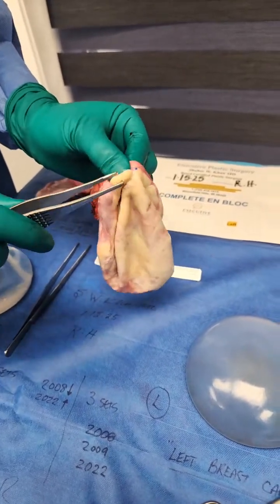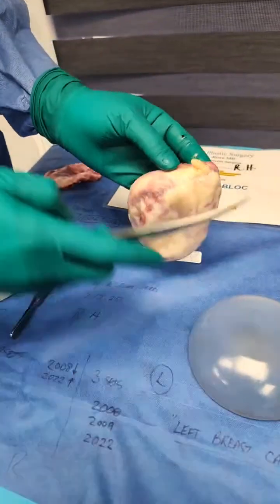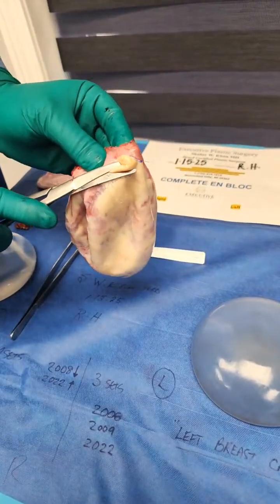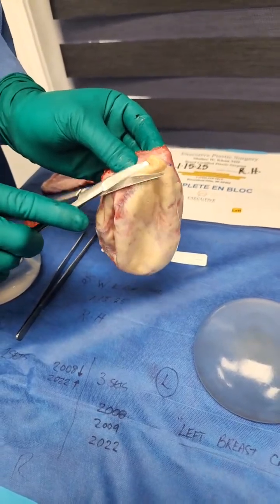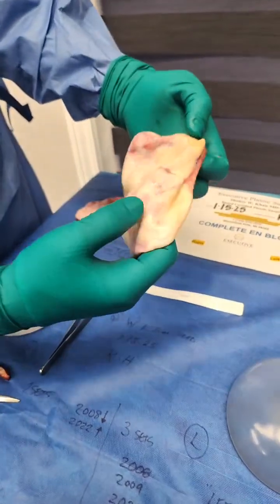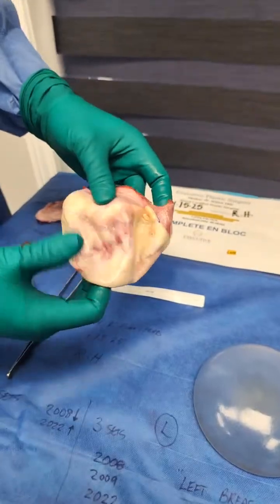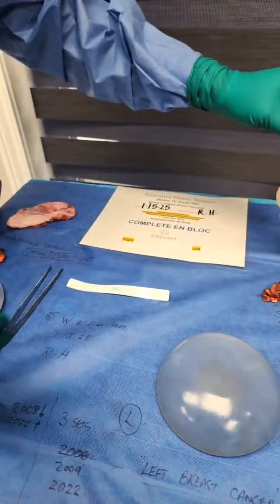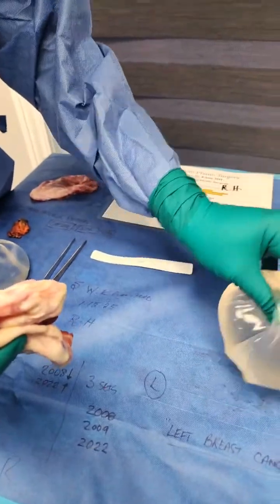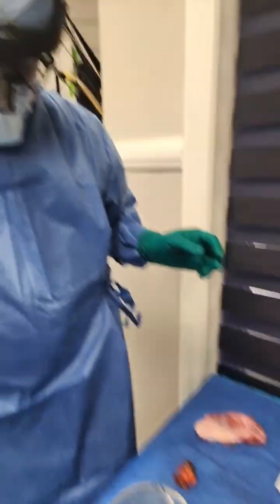Very thick. If I try to tear it with my hand, I cannot. And even if I try to cut it with my scissor, I'll tell you, my scissor is bending. You can see it's not going to be able to cut it. It's like a leather bottle, if you will. So you can see extensive amounts of this Prolene suture. So I am going to go ahead and the implants will be returned to the patient.